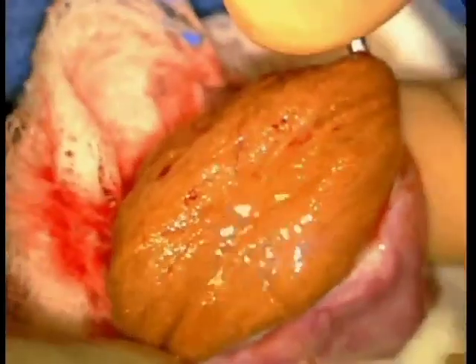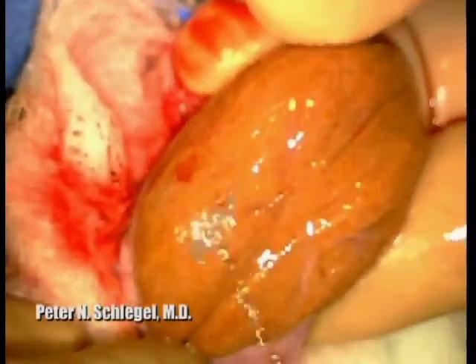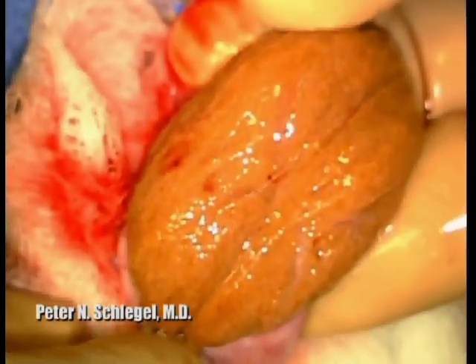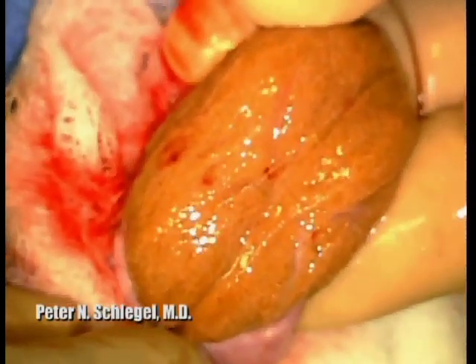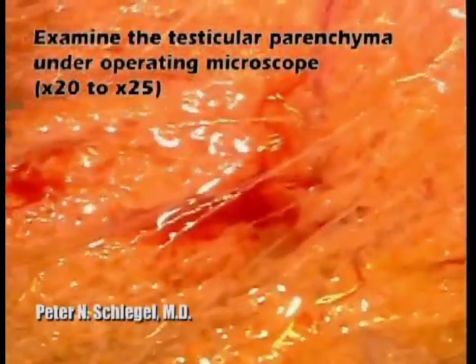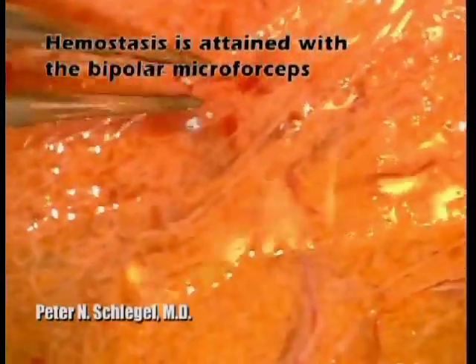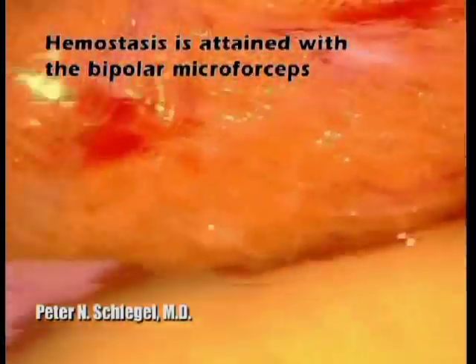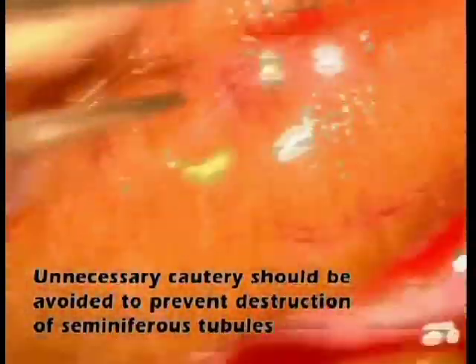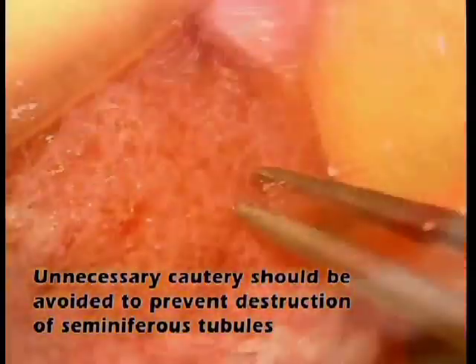After dividing the tunica albuginea along an equatorial, relatively avascular plane, the testicular tissue is averted, and the seminiferous tubules are examined under the operating microscope. Hemostasis is attained with bipolar microforceps. Unnecessary cautery should be avoided to prevent destruction of tubules.